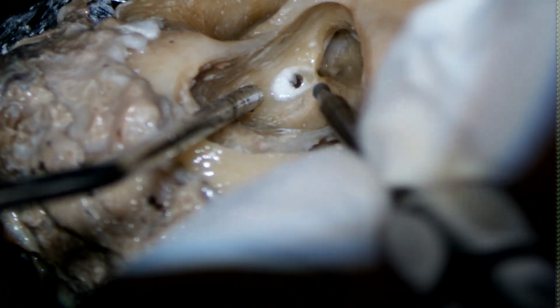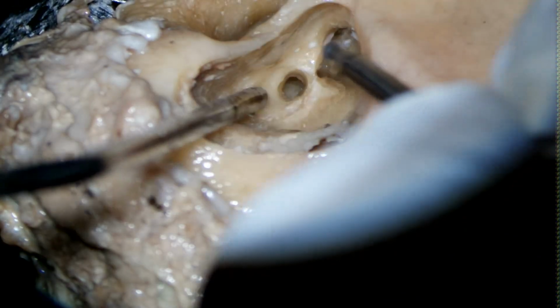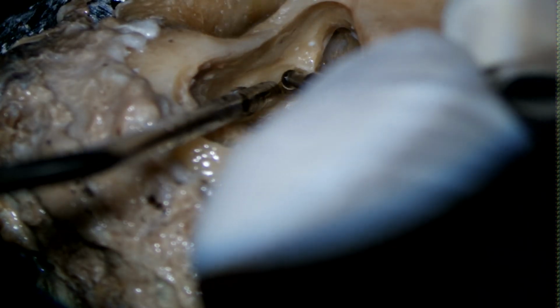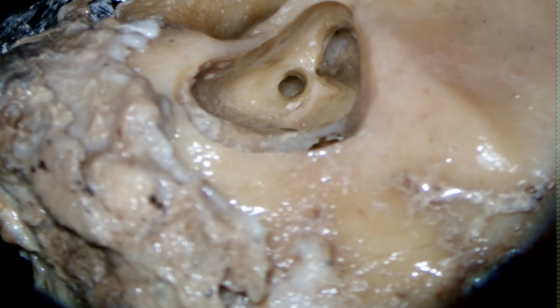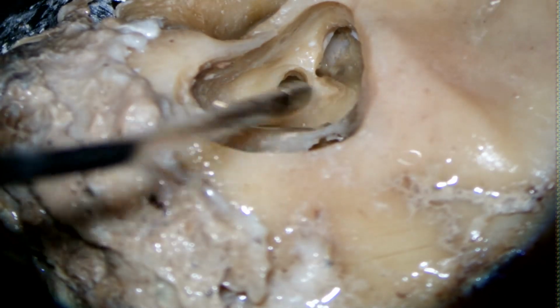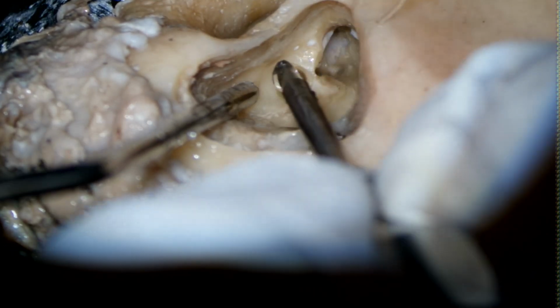Yes, okay, then you identify. Probably this is the portion of the facial nerve now. Do you see this? This is the exposed facial nerve here. Can you see this small opening? So this is the facial actually, right?